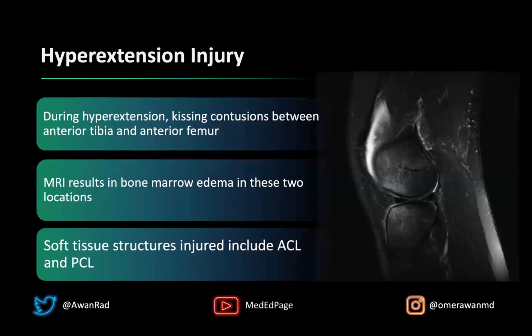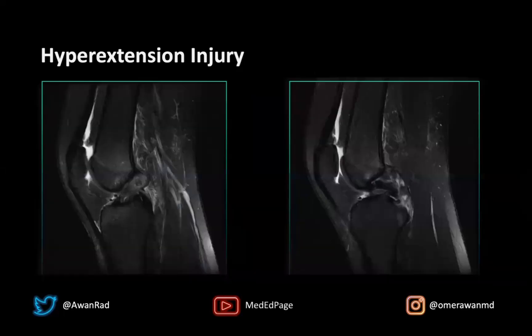When you see marrow edema in these two characteristic locations, you should always infer that both the cruciate ligaments — the anterior cruciate ligament and the posterior cruciate ligament — are injured. And you can see in this MRI that there is abnormality of the ACL. This is the anterior cruciate ligament — it's very thick and indistinct, indicating at least a sprain or a partial tear.